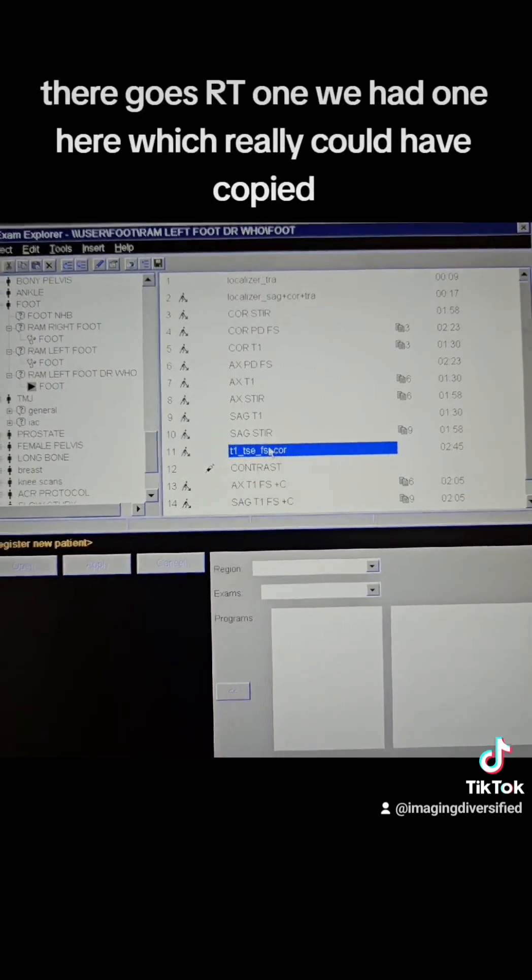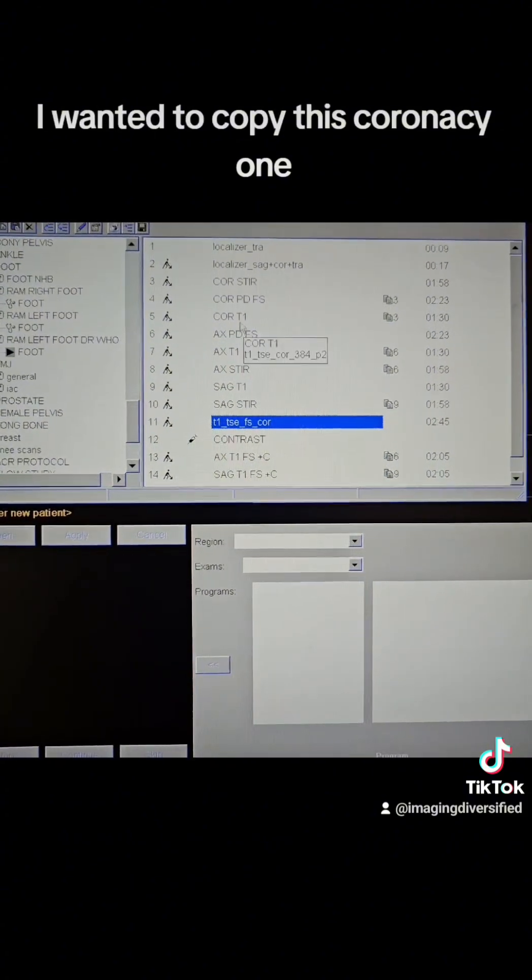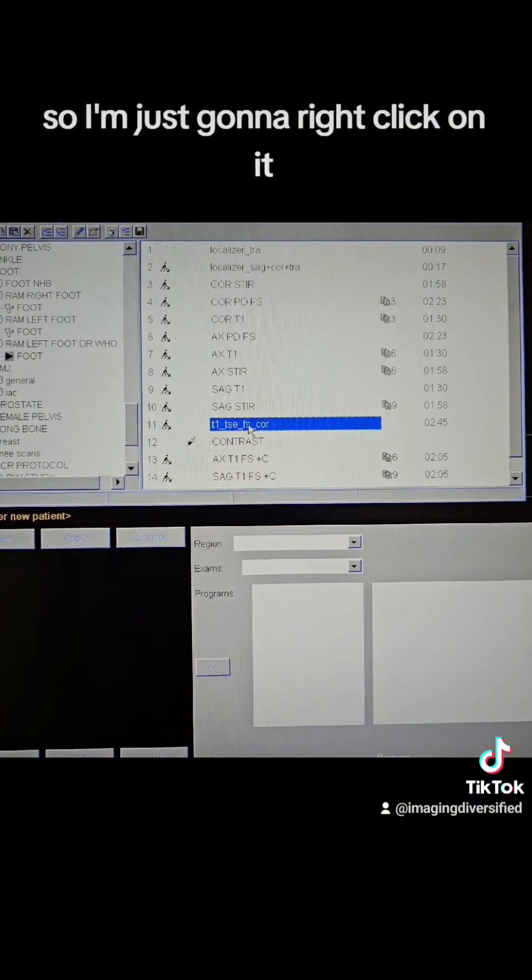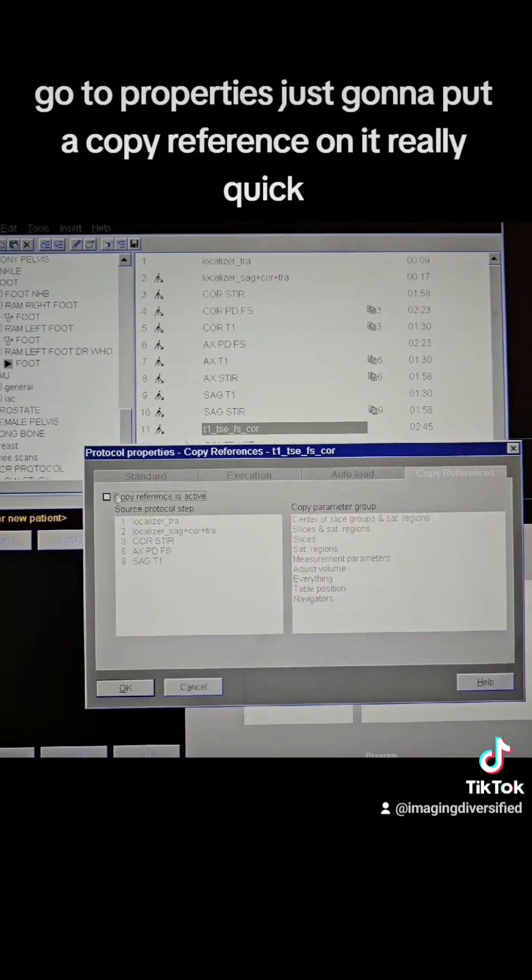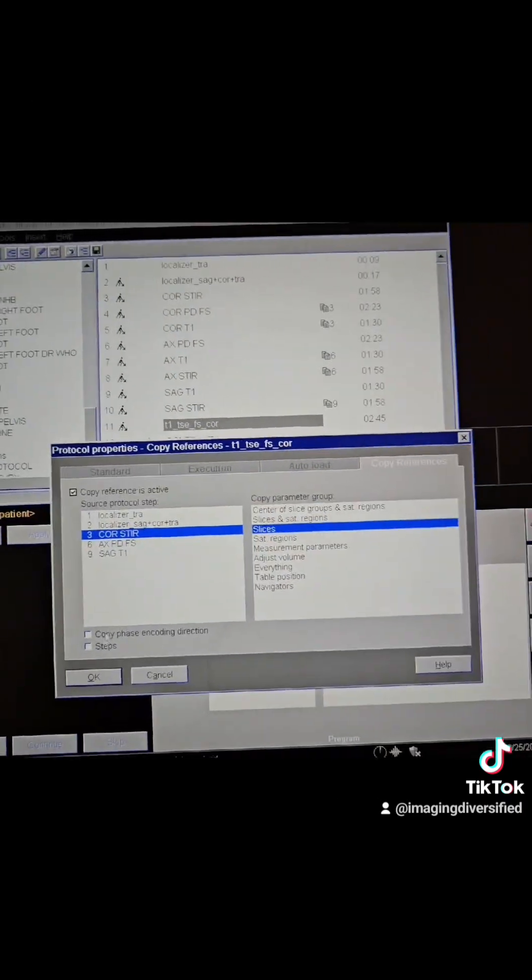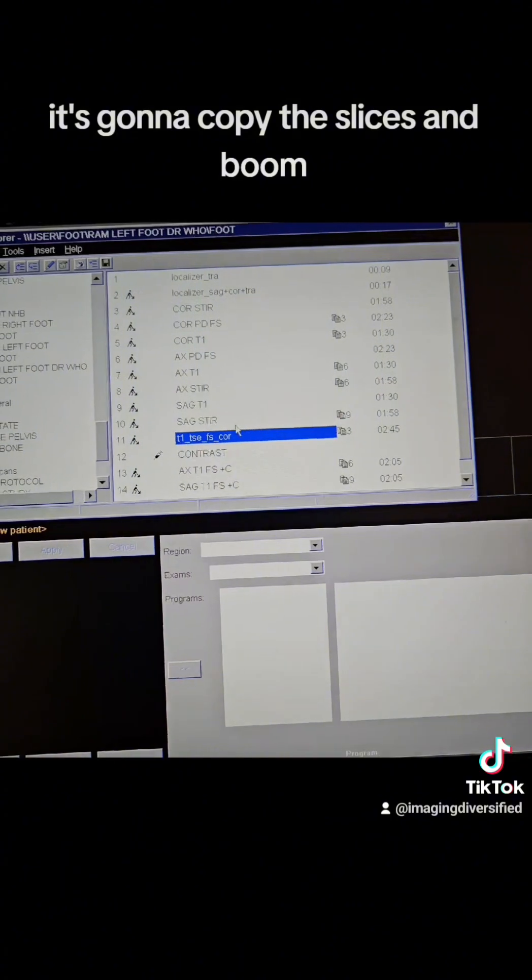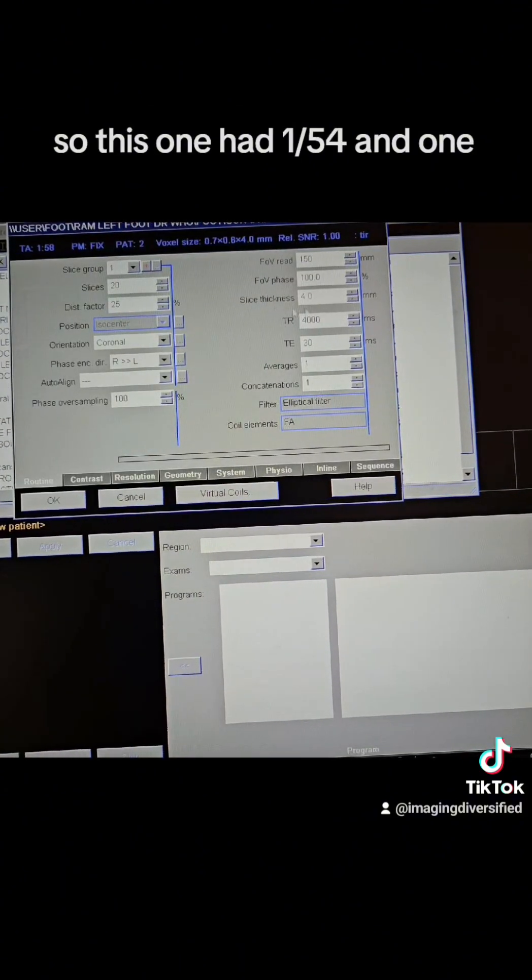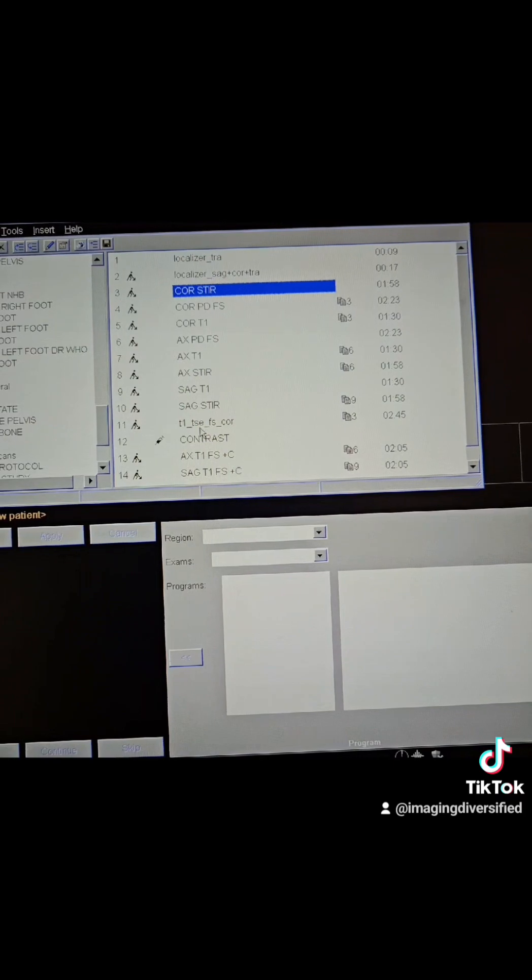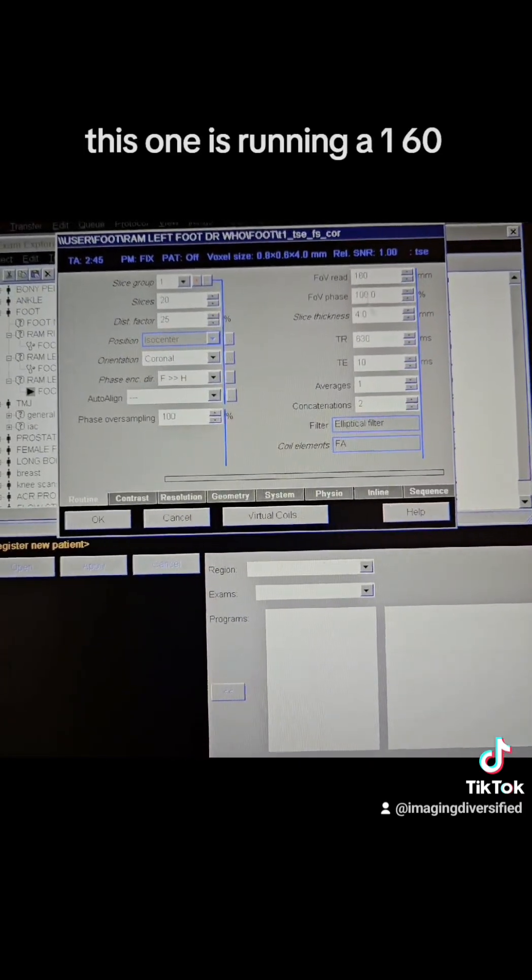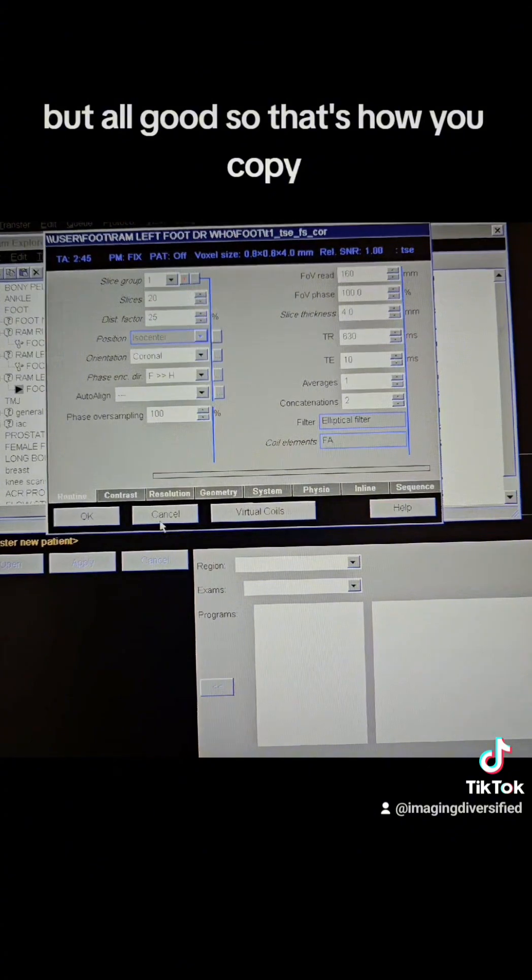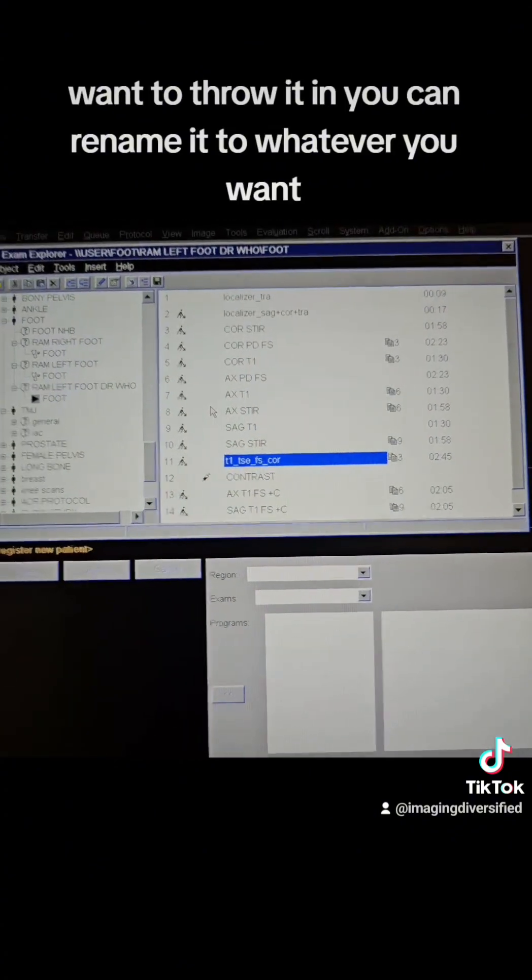It's all good because I'm going to paste that and there goes our T1. We had one here, which we really could have copied, but let's say we need to create one. I wanted to copy this coronal T1. So I'm just going to right click on it, go to properties, just going to put a copy reference on it really quick. I'm just going to copy the slices. So this one had 154 and one, this one is running a 160. So it probably was a little different, but it's all good. So that's how you copy one and throw it in. You can rename it to whatever you want.